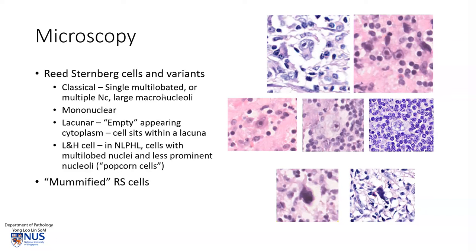Microscopically, Hodgkin lymphoma is recognized by the presence of Reed-Sternberg cells, which have a few variant appearances. The classical Reed-Sternberg cell is usually a cell with a single multi-lobated nucleus or several nuclei, most often two nuclei, which are very large and contain macronucleoli or extremely prominent nucleoli. Here is a binucleated Reed-Sternberg cell, and here is another binucleated Reed-Sternberg cell with very large nuclei and macronucleoli which are so large that they approximate the size of a small lymphocyte.